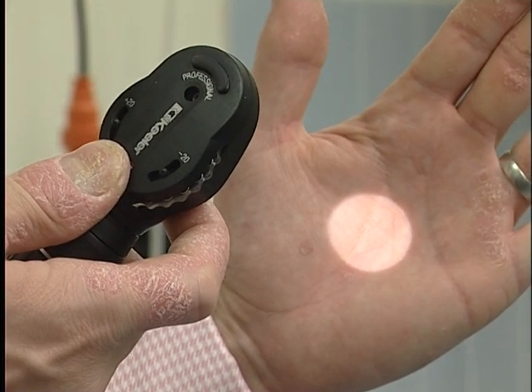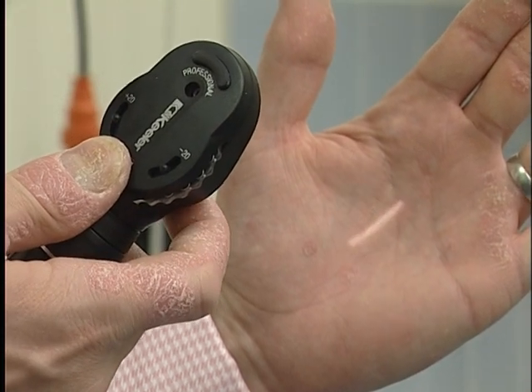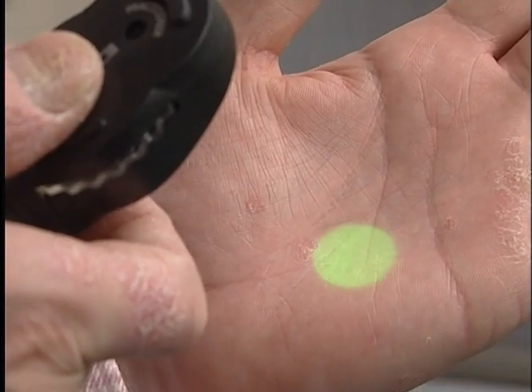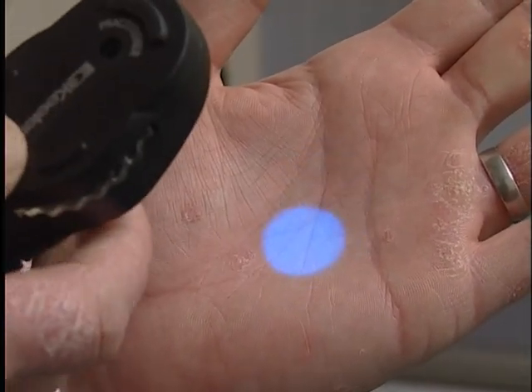On the direct ophthalmoscope, there are several different light beams available: 3 different widths of light beam depending on pupil size, a slit beam and a graticule beam. Most ophthalmoscopes will also have a red-free filter, green light, for vascular examination and a cobalt blue filter for fluorescein examination.